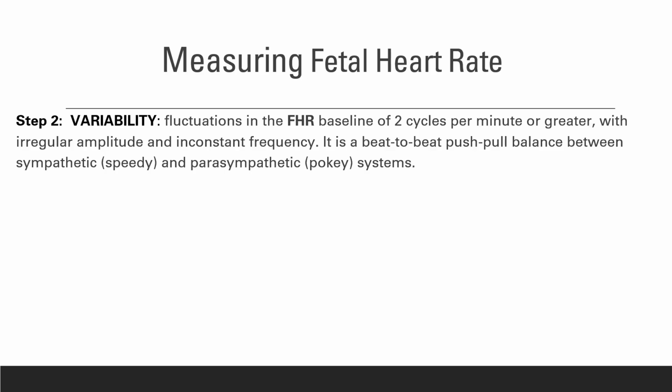Again, this terminology that you see in front of you is very, very important. Please make sure you understand what a baseline is, what the variability is, what an acceleration is, and what the deceleration is as you're measuring fetal heart rate tracing.